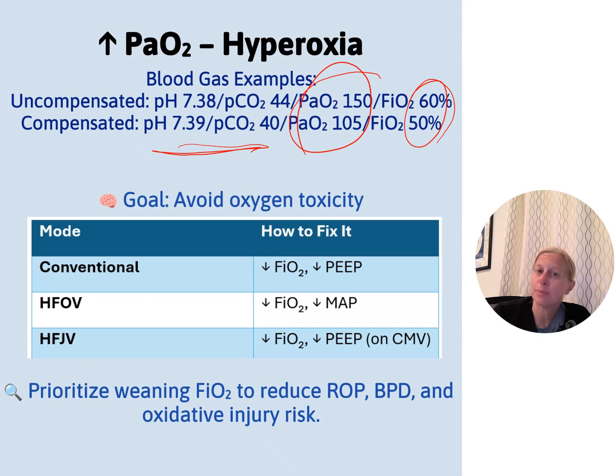And often babies are put on the jet because of overexpansion in the setting of poor gases or poor oxygenation in really high settings on a conventional ventilator. And so we put them on the jet to start to decrease this overinflation from PIP, PEEP, right? Those breaths on the conventional ventilator. So the jet rate, yes, you could decrease that in the setting of some of these respiratory alkalosis or this hyperoxia, but it's not often our first choice.